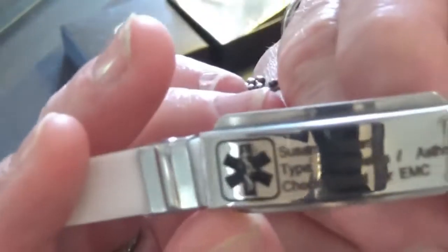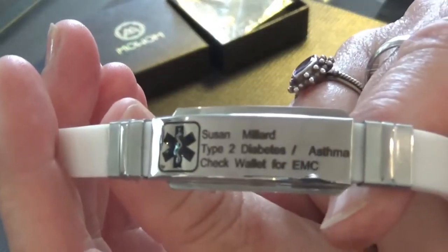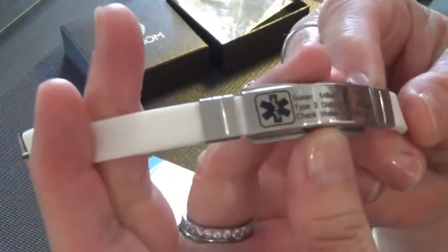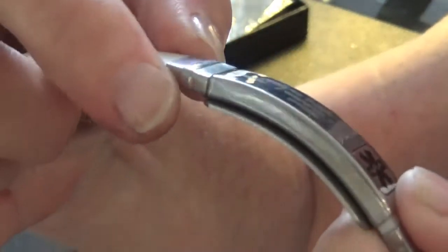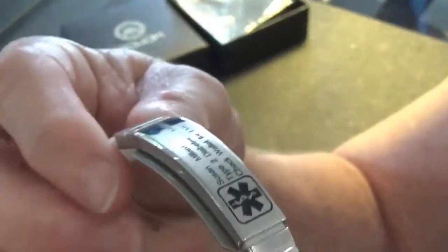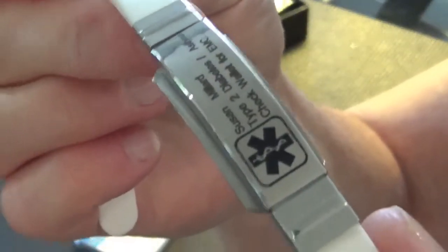It got more on the front than the bracelet I paid more for. This one didn't print my medications, whereas the MauWam has them on the back. Because this is worn like a watch band it doesn't flip around. It is curved to better suit your wrist, naturally curved, and these two stays do move down the band so you can adjust the clasp to where you want it — under your arm or wherever — to make it as comfortable as you need.